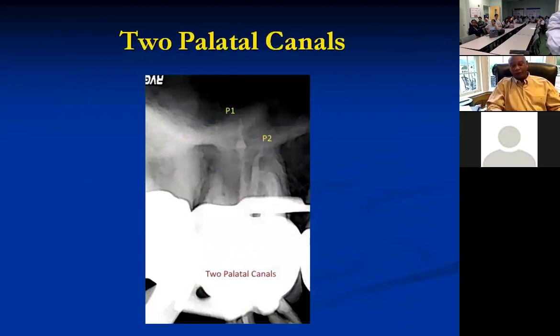Okay, and we did find 2 canals on the mesial buccal root. Question. Sure. When you're looking at that from the palatal, what anatomy on the pulpal floor is maybe hinting to you to say, hey, there may be a 2nd canal on the palatal, in addition to you already thinking that there's a 4th canal somewhere in the mesial? Correct. All right, that's a good question.